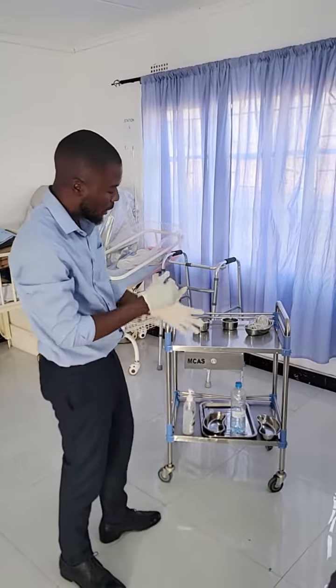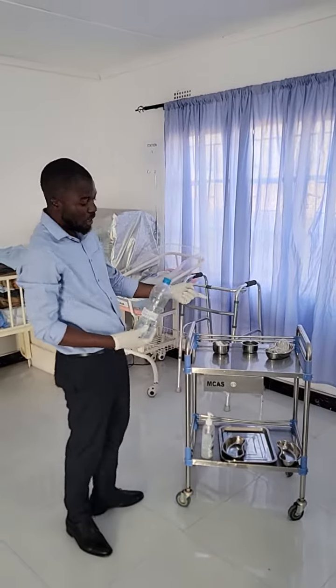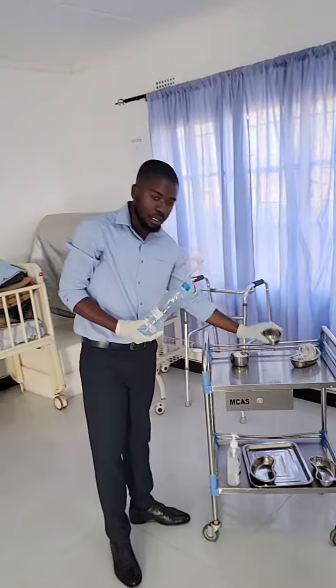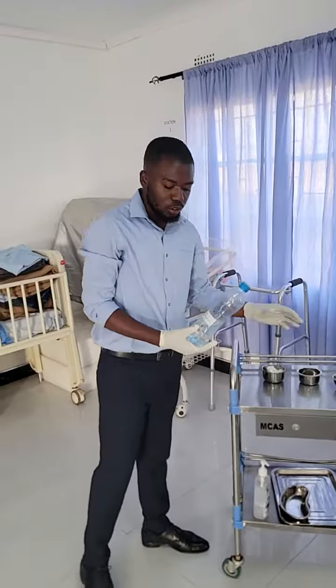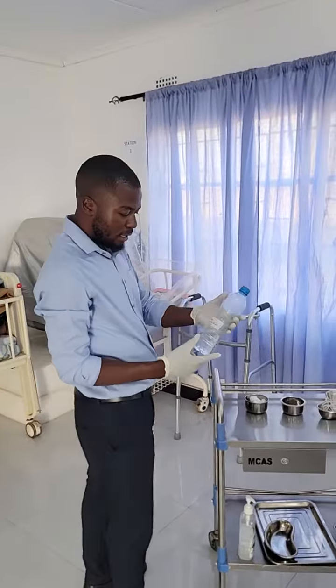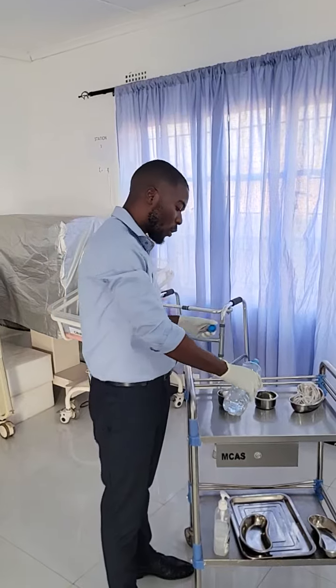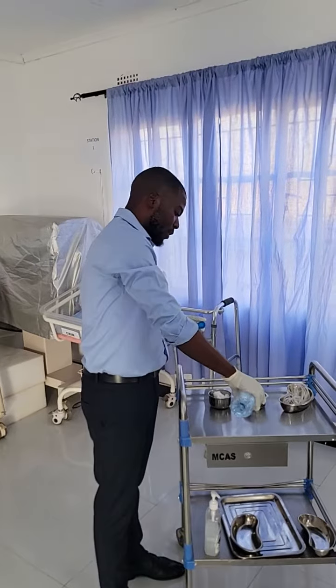After donning gloves, the next move will be to pour sodium bicarbonate into the galley pot. You say, my examiner, this is sodium bicarbonate, the expiry date is in 2028. This is just a clean procedure, so you can close here. Just pour there.